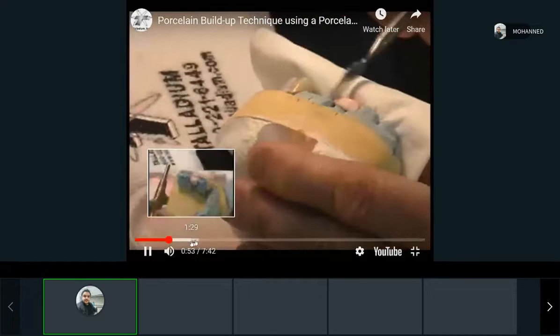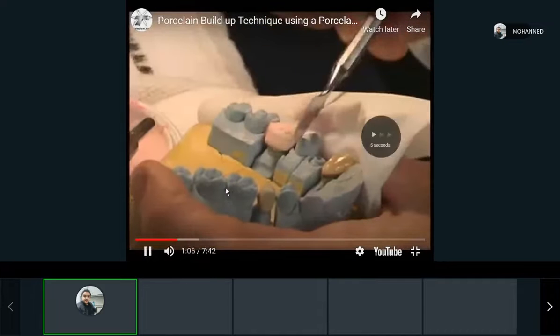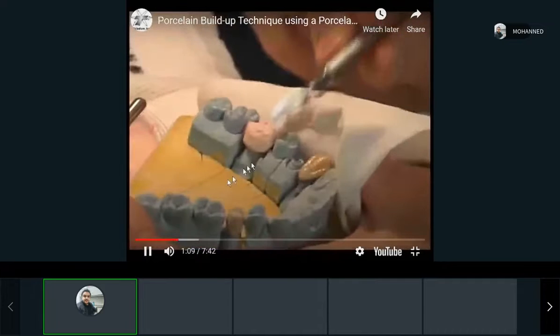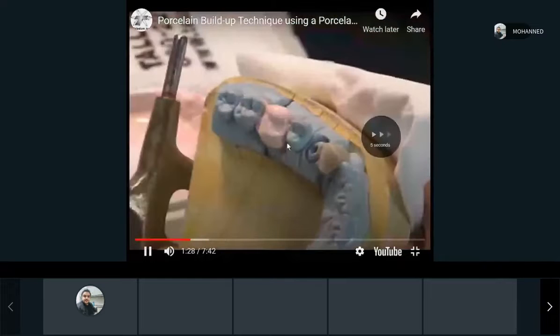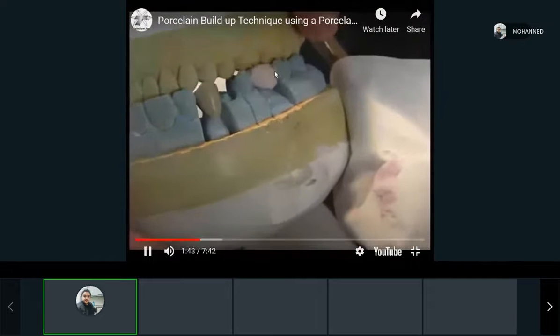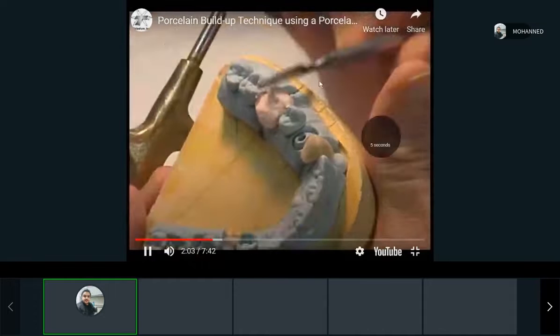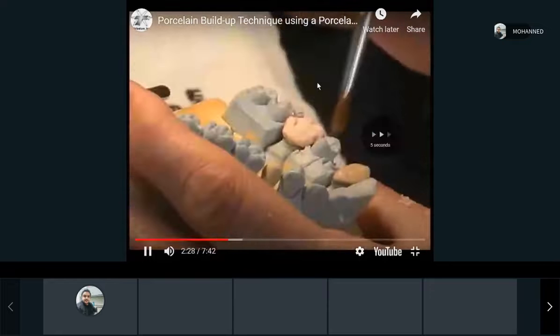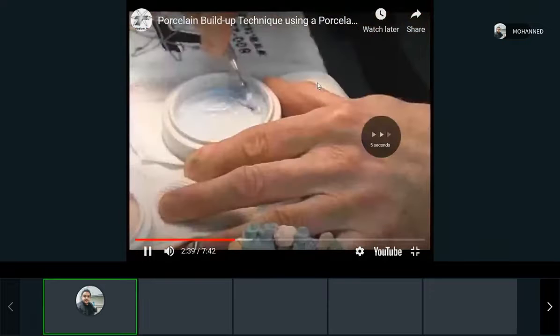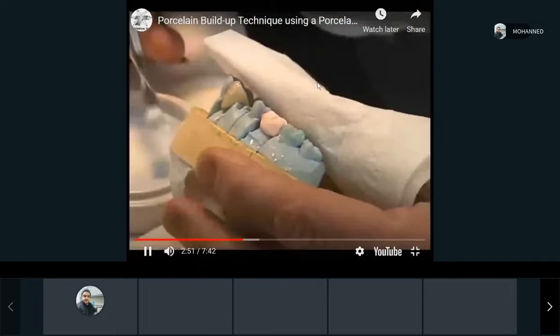You see, this is all, again, porcelain. So they're putting layers, making it nice. And keep building, building, making sure that occlusion is correct, right? That's why we send the bite registration, so they can mount it and check the occlusion. They keep building it, building it, building it. Keep going at it. They're adding different layers for different shades.